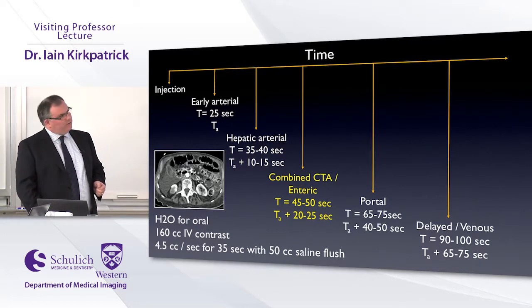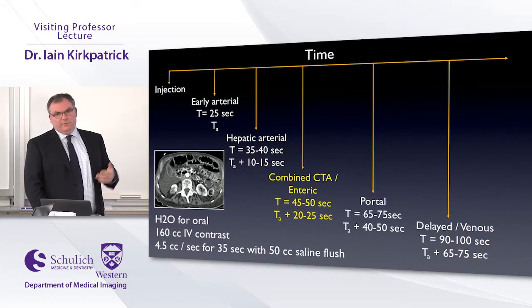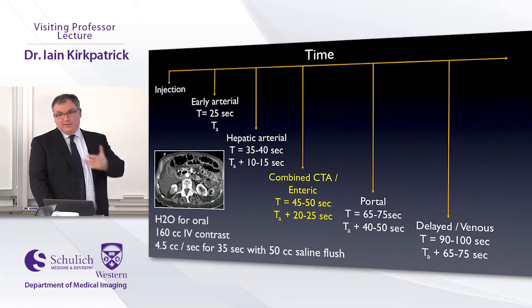I have to say though, after doing multi-phase enterography on a number of cases, I did not find the yield to be impressive at all. In fact, I cannot recall a single case that I personally have read where I thought it added anything. And when I surveyed my colleagues before I made this talk a little while back, none of them could either. So I don't know. Are you guys doing multi-phase enterography at all? No, yeah.